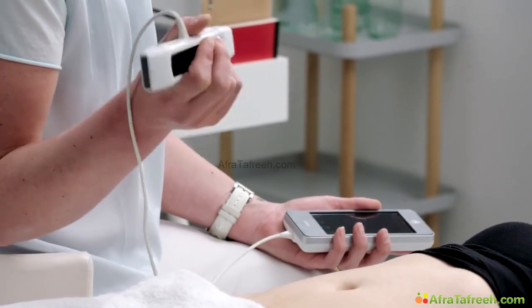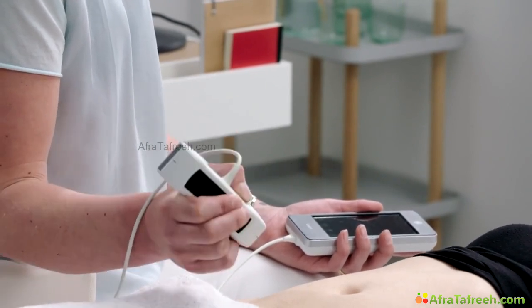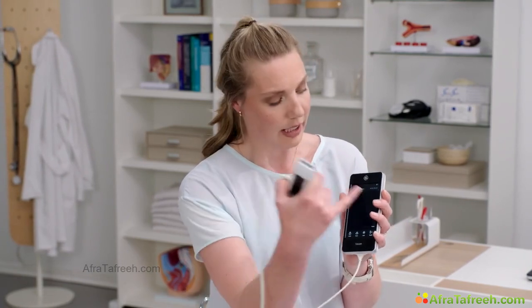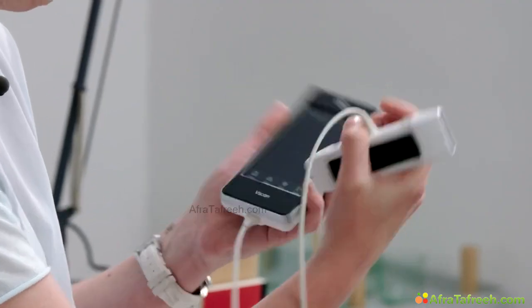Try to have your probe always, when you look in a sagittal way, with the navigation point towards the head of the woman. That means cranial. If you rotate the transducer to a transverse view, then be aware that your navigation point is pointing to the right side of the woman. Then you're sure that in your screen, always in transverse, this is the right side and this is the left side. And if you change your transducer from transverse to longitudinal, you know that this is the head of the woman and this side is her feet.